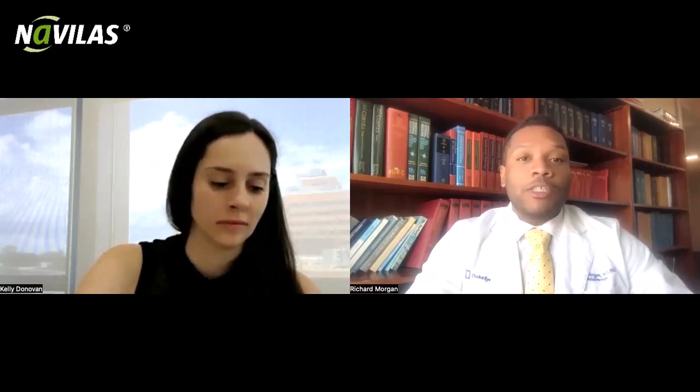We also emphasize that patients really need to stay positioned for extended periods of time while getting treatment, with their forehead pressed firmly against the forehead strap. I've noticed that patients tend to try to help us by looking in the direction of the laser, and I always tell them to try to fixate on my ear or somewhere off in the distance behind me. Additionally, I like to highlight the precision and added safety of the Navilas system to help them get over any anxiety about getting treatment. This helps manage their expectations and improves their satisfaction and outcomes.